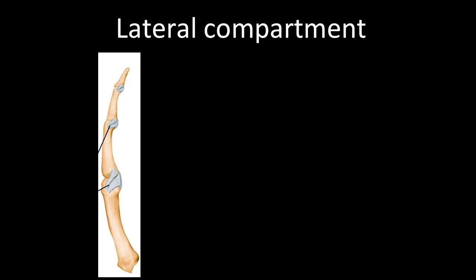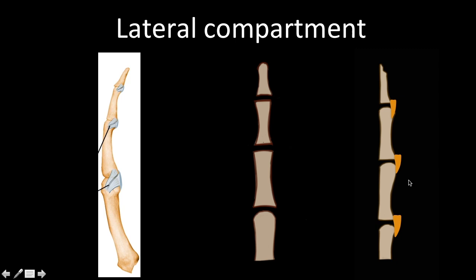Now the lateral compartment. Laterally there are only two structures: the radial and ulnar collateral ligaments. On the sagittal image, they arise dorsally from the proximal bone and distally attach more on the volar aspect. Technically there are proper and accessory components on both sides, but clinically this distinction is not important — you simply need to know there are radial and ulnar collateral ligaments at each joint.